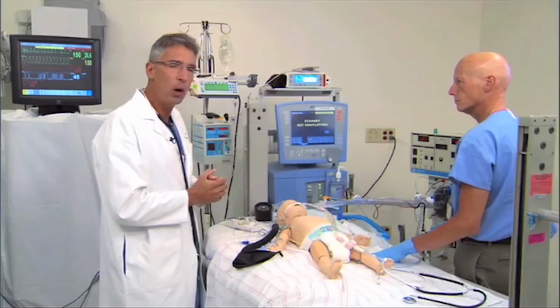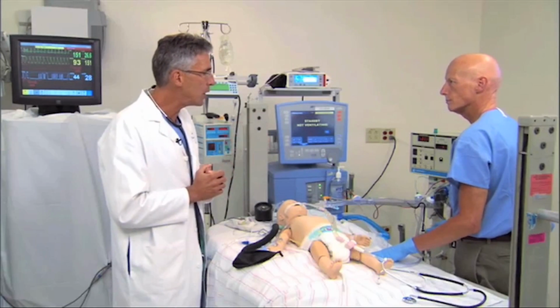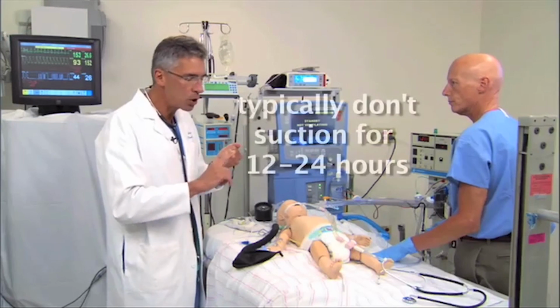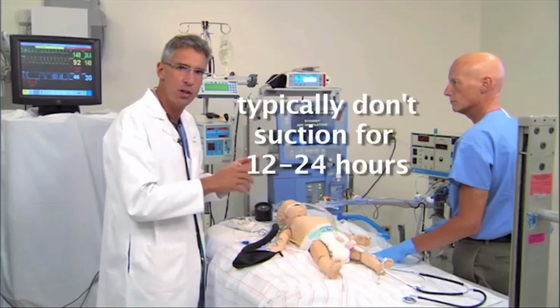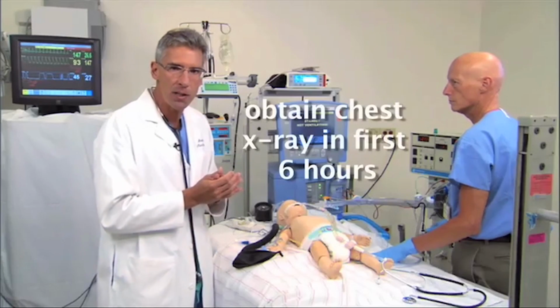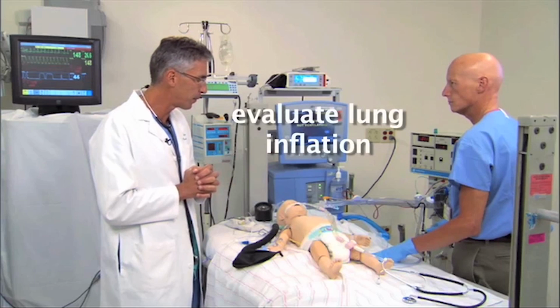So at this stage, the patient has a nice physiologic hemodynamic profile. We've demonstrated a fully open lung. We're on 60% oxygen. Now it's time to be patient. We typically won't suction this patient for the next 12 to 24 hours. That's another reason to perform aggressive suction just before transition. And I think at some point in the next 6 hours, a chest x-ray is helpful to make sure that we haven't produced lung overinflation.